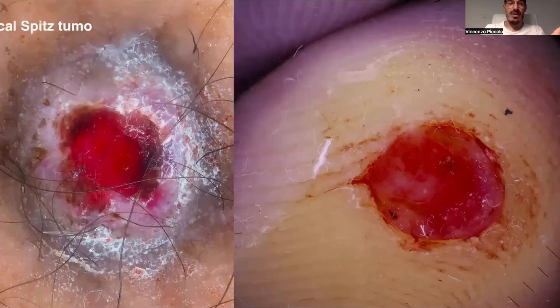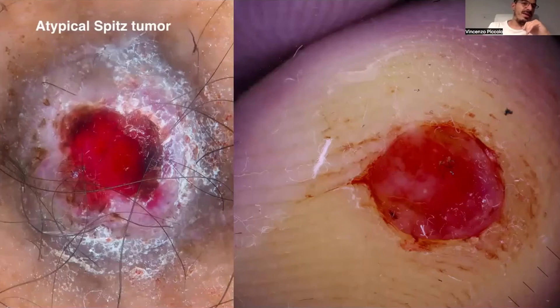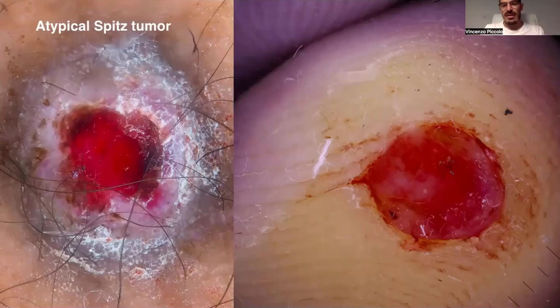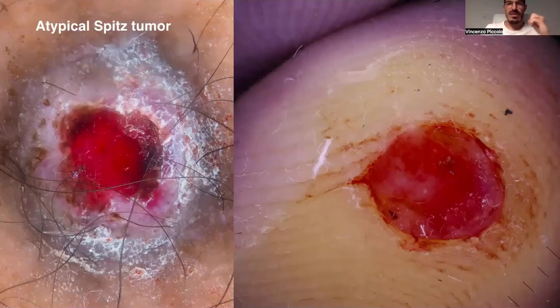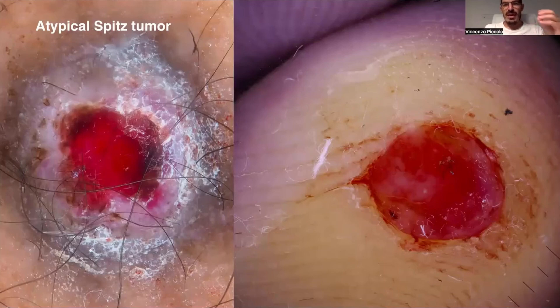But while on the right we have a pyogenic granuloma, on the left we have an atypical Spitz tumor. Once again I repeat: histopathological confirmation is mandatory in pyogenic granuloma in order to exclude hypomelanotic melanocytic tumors.